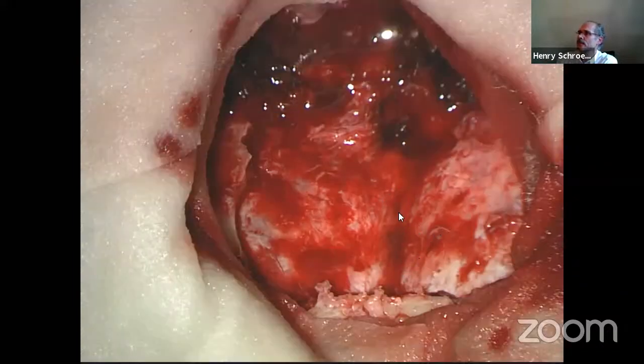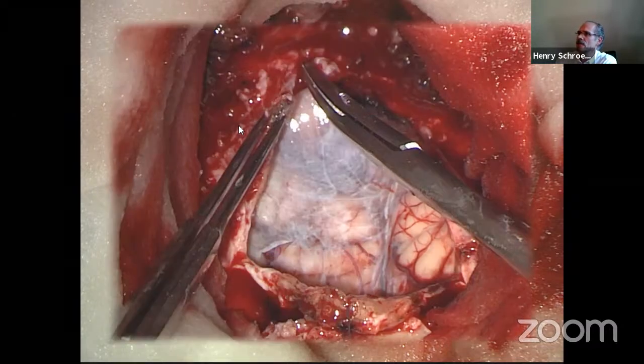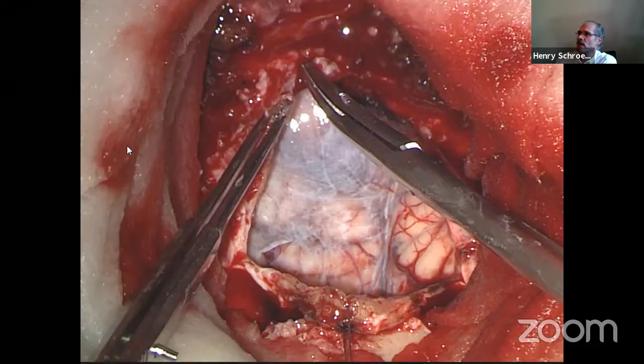And then we have here the midline and these are the cerebellar hemispheres. Then we make a Y-shaped incision of the dura, and the sutures are tacked to the muscle. So we don't have tacking sutures affixed to a clamp to bring it out, but we want to pull it laterally. So I fix it to the muscle on the lateral side. And then the dura is opened.